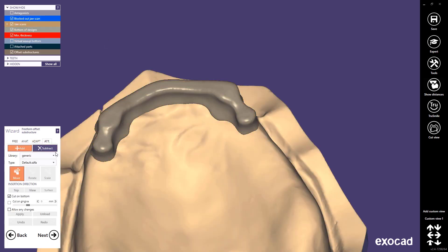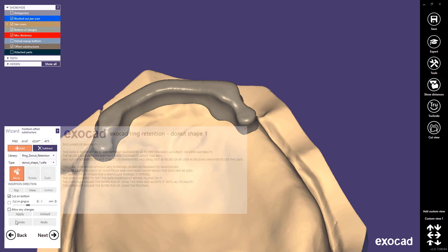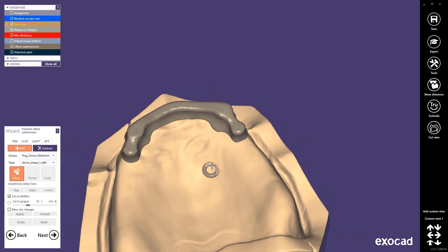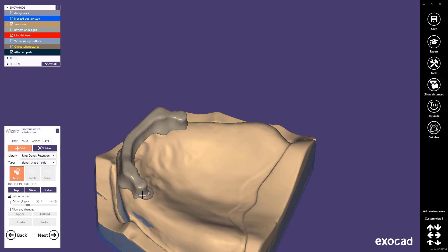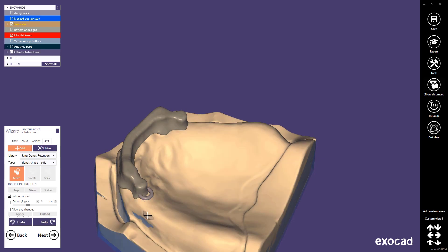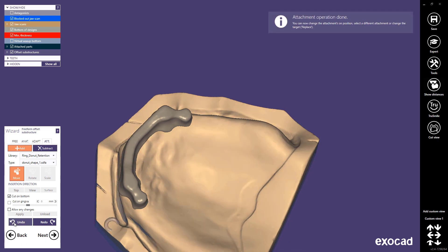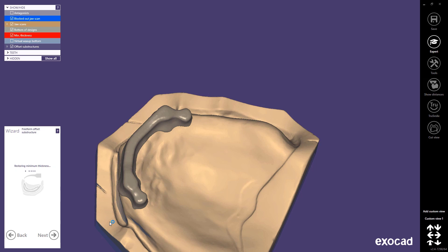Since the Plovdiff release we can now import our new ring donut retention to create more retention for the acrylic part. In this case there is no need to create an extra retention, so click undo and click next to finalize the design.